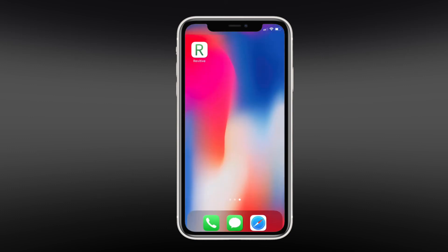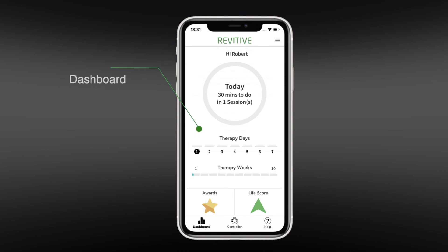Now that your device is paired successfully to your phone, each time you open the app the dashboard screen will appear. This is your home screen from where you can access all of the app's features. Tap the controller button to access the controller screen.